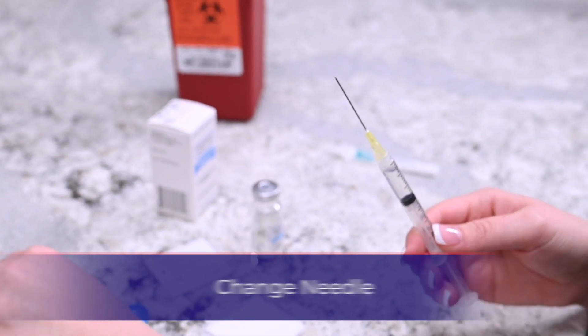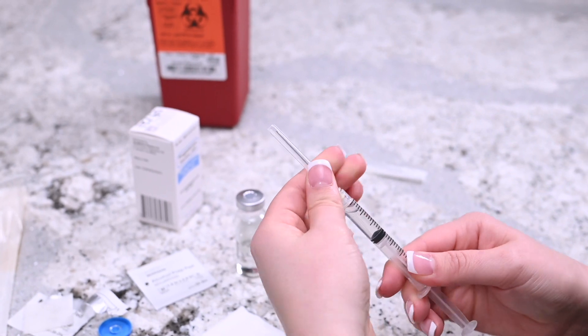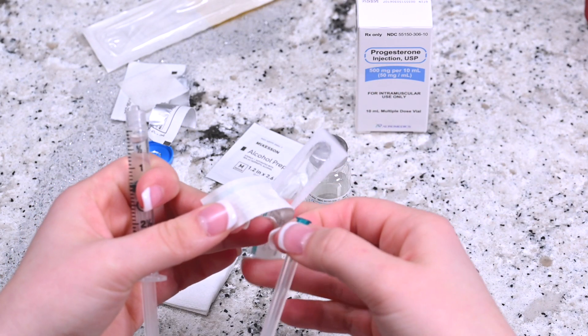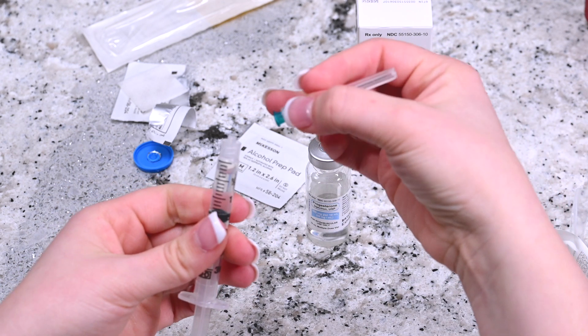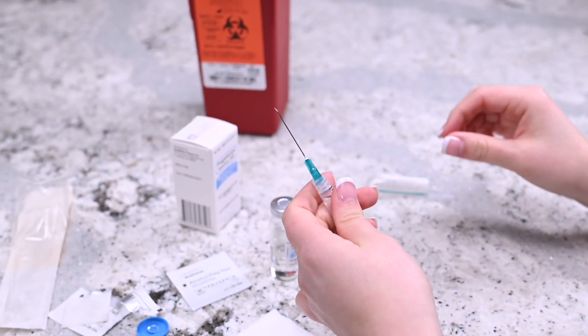Twist off the needle and place it in the designated sharps container. Remove the 23-gauge needle from the packaging and attach it to the syringe. Hold the needle upright and remove the cap. Do not let the needle touch anything, including your hands.